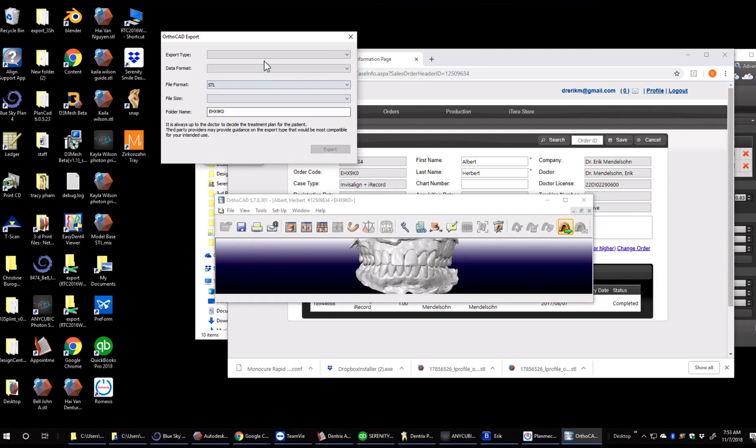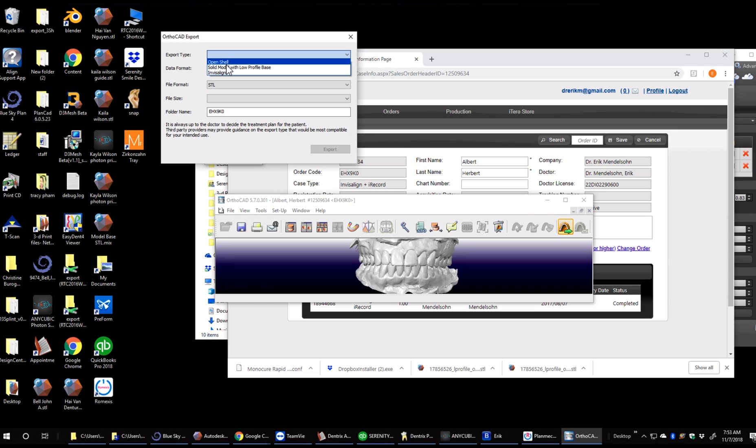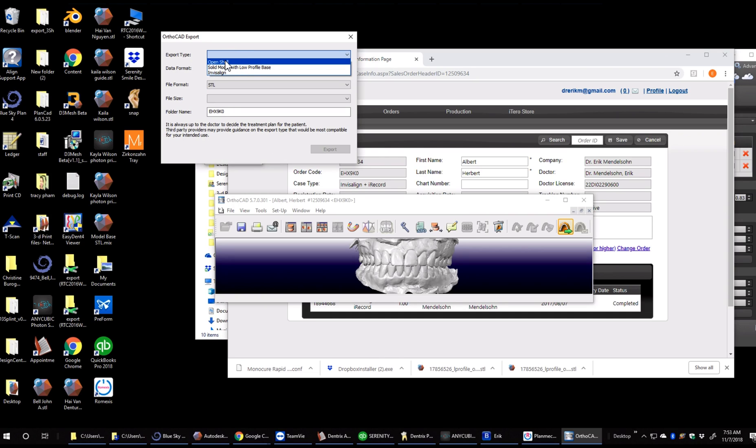Once that opens up, there's two export file types we use. OpenShell is for sending to a lab, using in Blue Sky Bio, and a few other third-party softwares. Solid model with a base is what we're typically going to use for in-house printing. I'm going to pick the OpenShell for now.